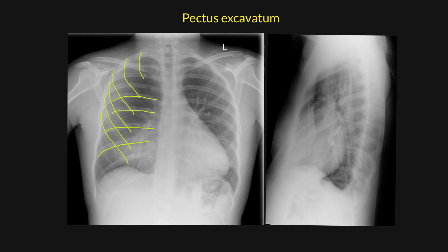It should be noted, however, that this diagnosis should actually be made clinically, simply because it can be made clinically, and to do a lateral chest radiograph is unnecessary radiation. So, coupled with an x-ray that appears like this, with a patient who clearly has pectus excavatum clinically, this is all that is required.